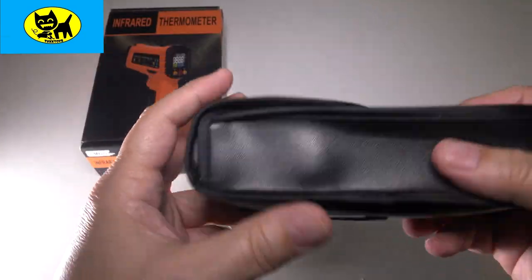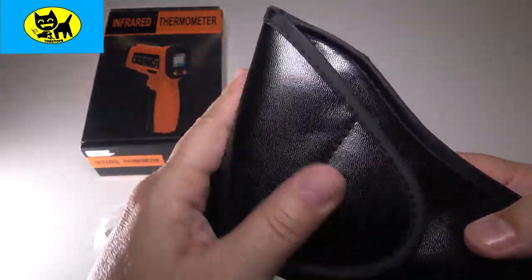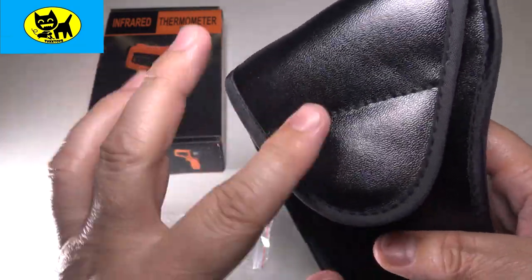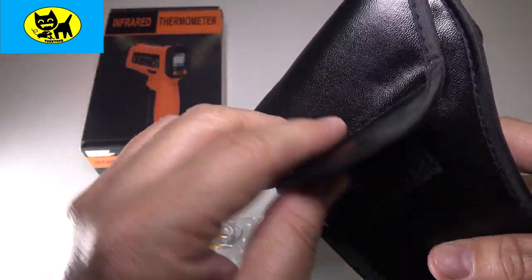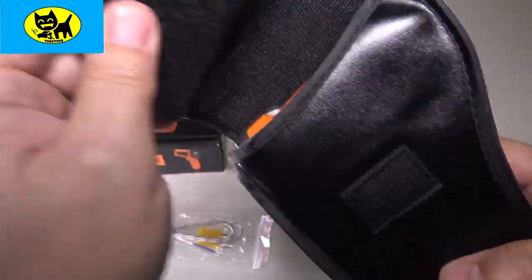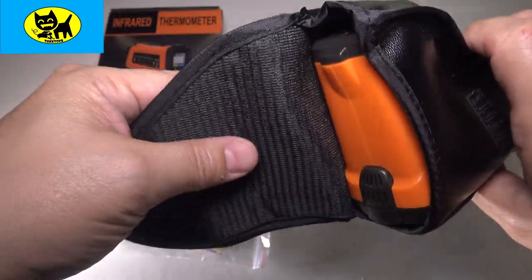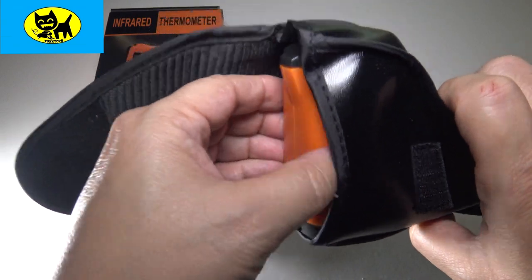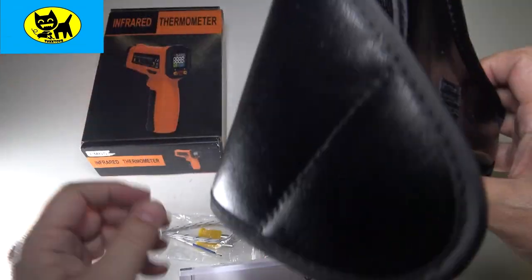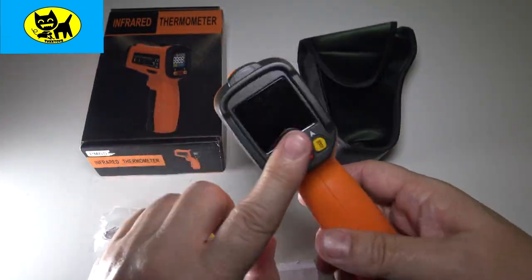Looking at the case, it's a really nice case — I'm definitely digging this. It's not leather but has a leathery feel to it. It's velcro-open, and there's a little stitch here; they actually have a pre-made crease for opening it past the velcro, which is very cool. Inside, it exposes the device nicely — it's padded to protect it if you drop it. There's also an instruction manual and a nice little belt loop.